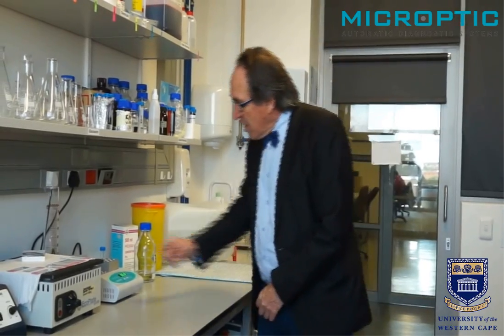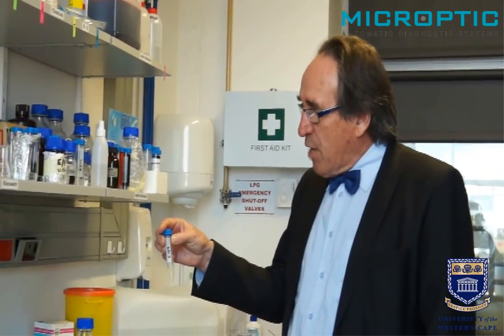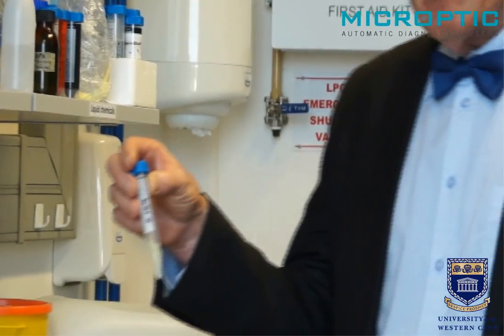Let me show you briefly how the technique works. I have already determined the sperm concentration in this sample, which is around 20 million sperm per milliliter. This is absolutely ideal for testing — for challenging the sperm in the seminal plasma.